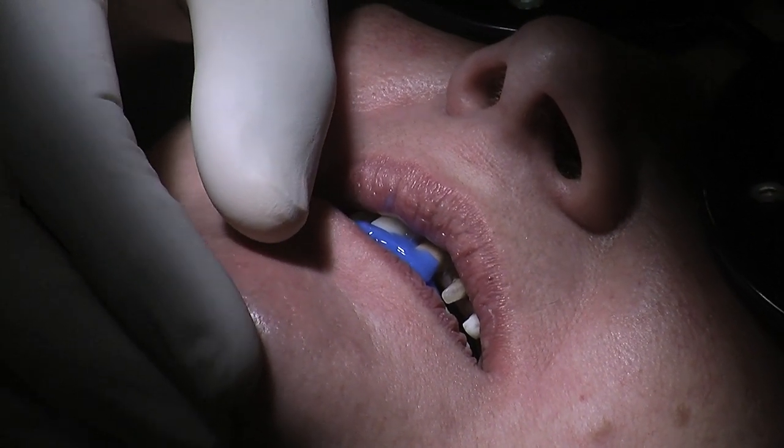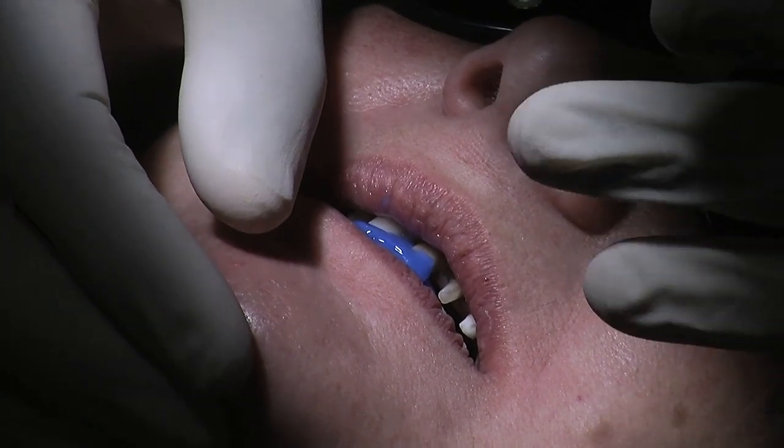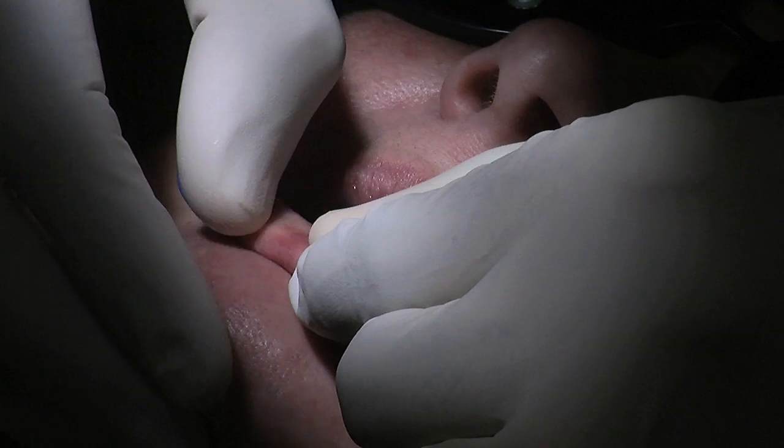Another trick you could use is just ask the patient to open and close slightly after about a minute. But in this particular case, I won't — though that is something you can do. And this also warms up as it sets hard, so it's important just to let the patient know it may get a little bit hot.